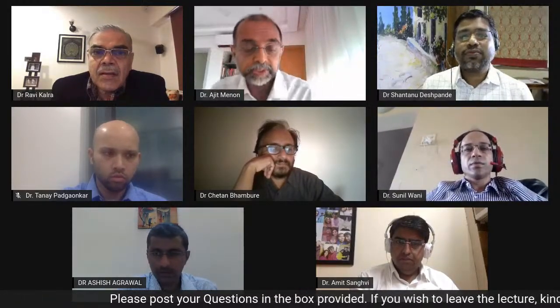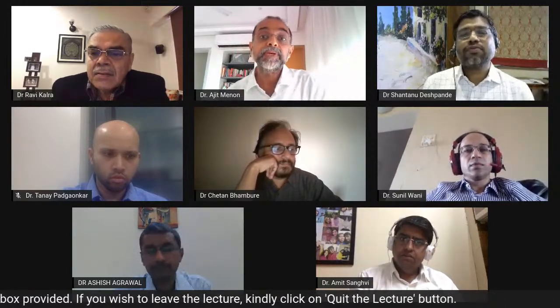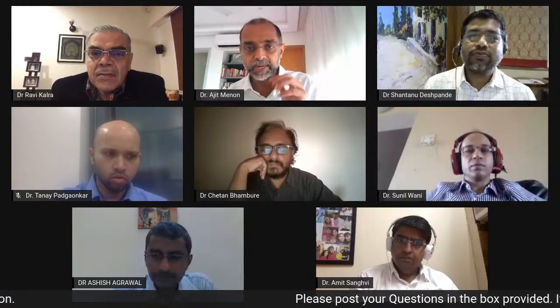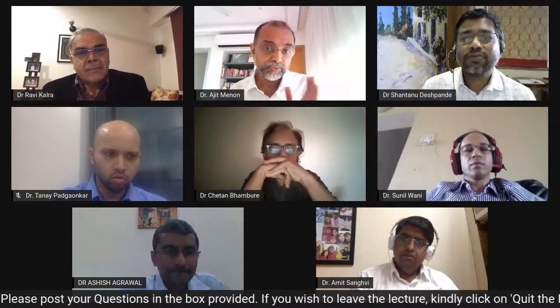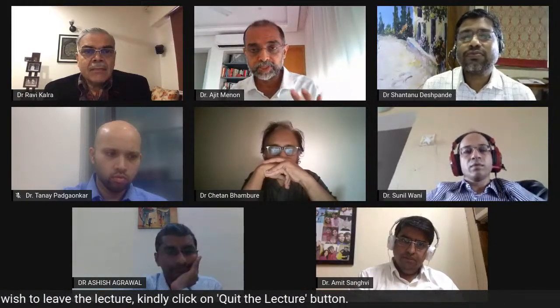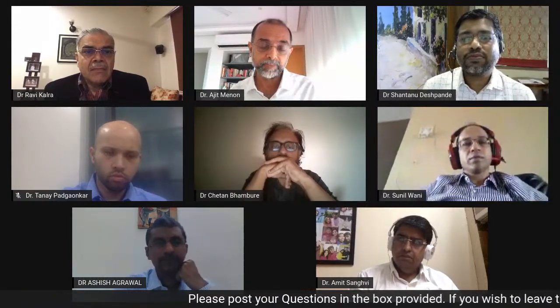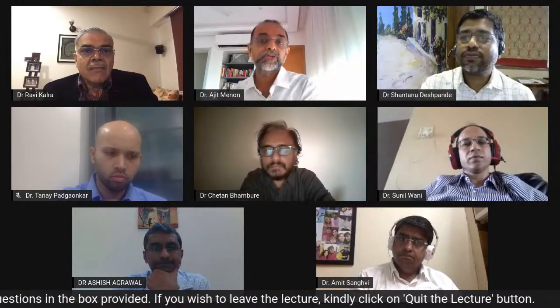I agree. Be very cautious when you're using the Corsair in calcific lesions, where the tip can get stuck and you will have difficulty in retrieving it. Now, in this situation, one comment I had to make is you did the rotablation of the lesion, and after that you found that there was no good flow down the vessel. Two thoughts come to mind. One is the vessel is badly diseased, or there's a flap somewhere which is compromising the flow. The second possibility is distal embolization of the calcific material into the distal vessels.